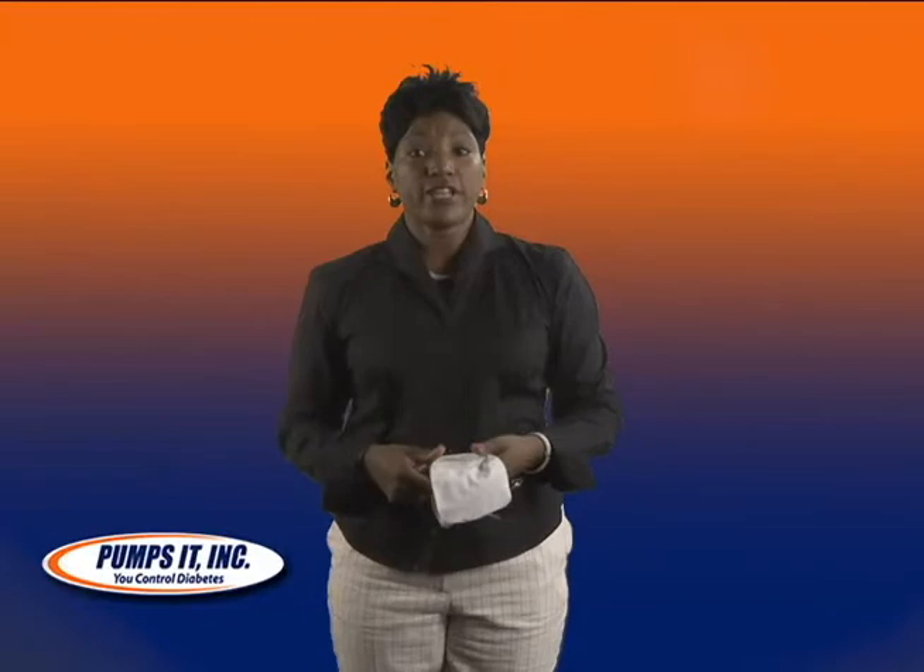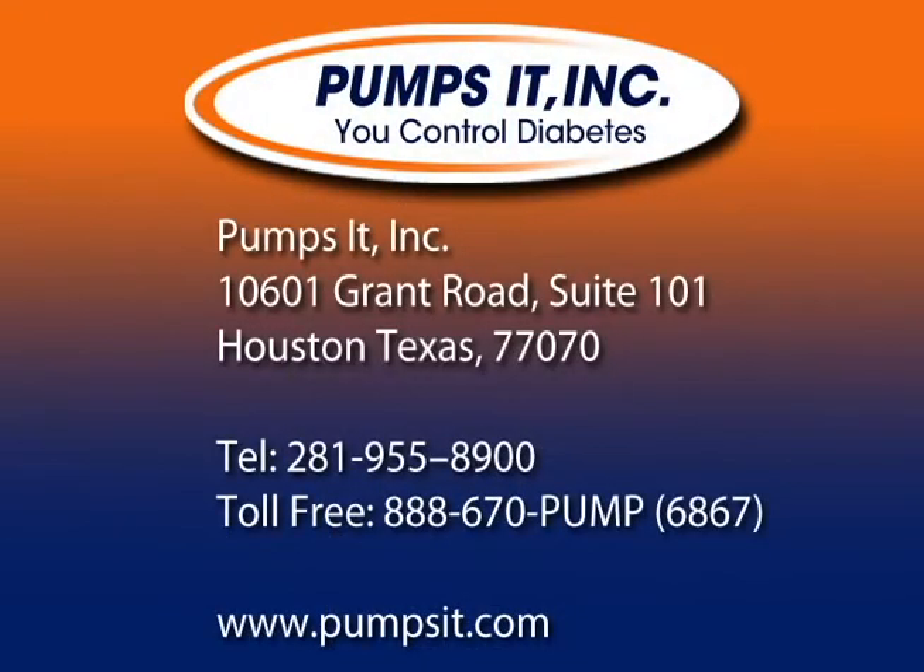This is just a few of the ways that you can wear your insulin pump. For more tips, check us out at www.pumpsit.com.